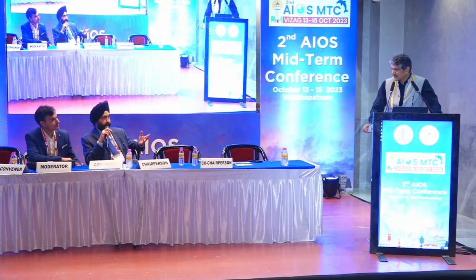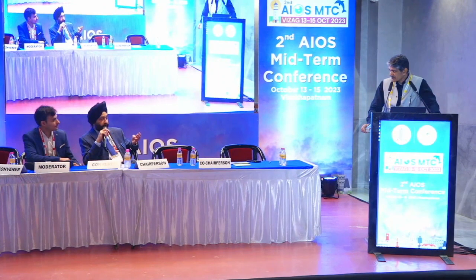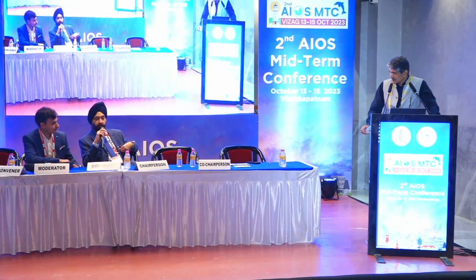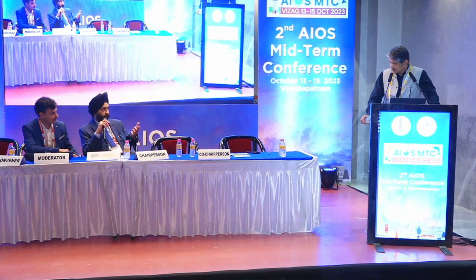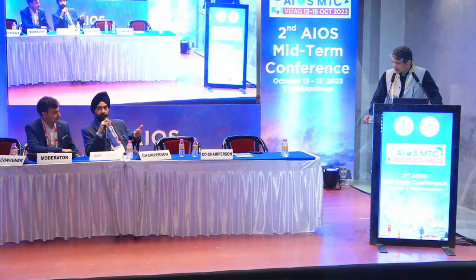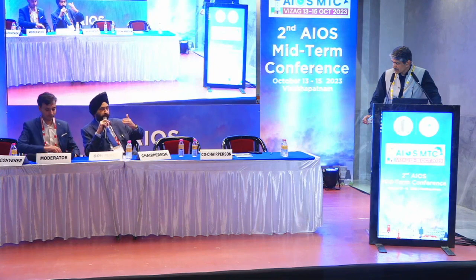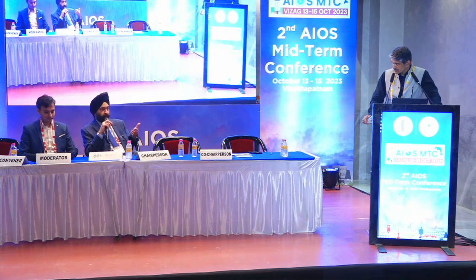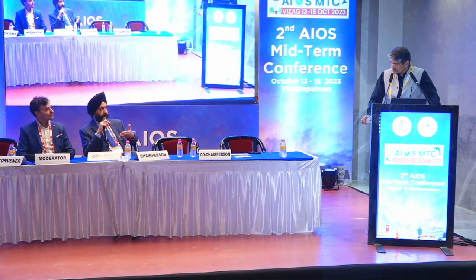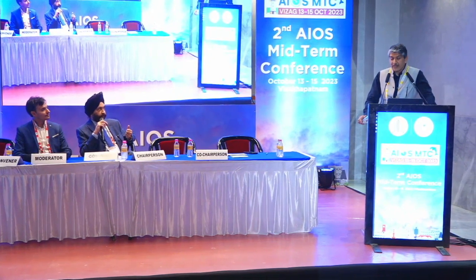So there were approximately 3 major criticisms for the SMILE procedure, specifically in the FDA trial, because the energy utilization, etc., was not optimal. So the first thing was slow recovery of vision. Just from the point of view of the audience, I am asking, how many of your patients achieve 20/20 or 6/6 vision the next day? You see, it's almost 99%. Okay, and is there any difference between 500 and 800 as regards vision?